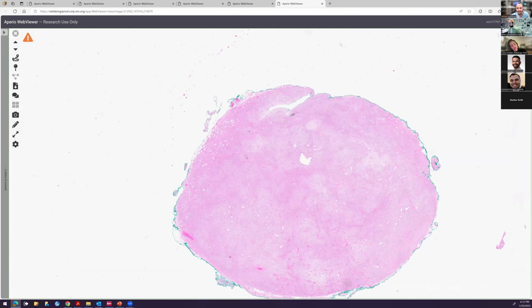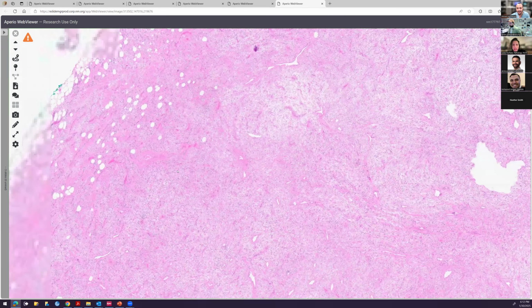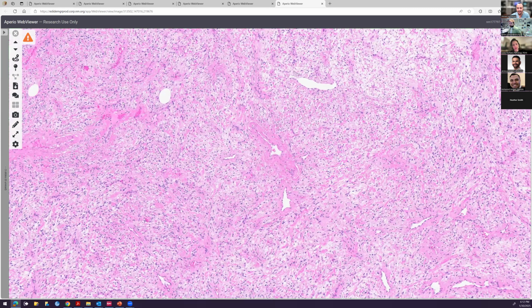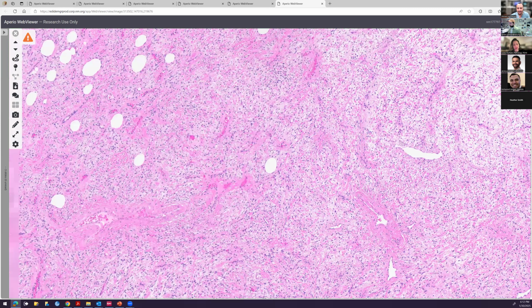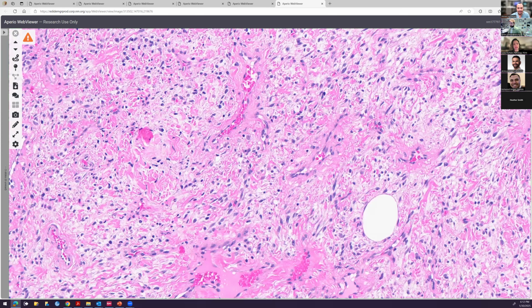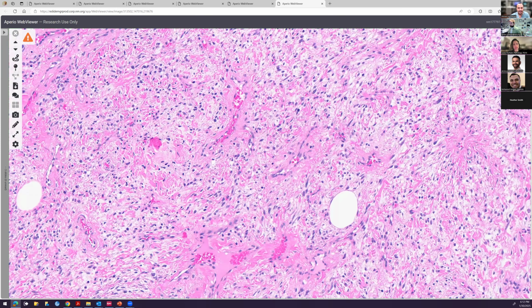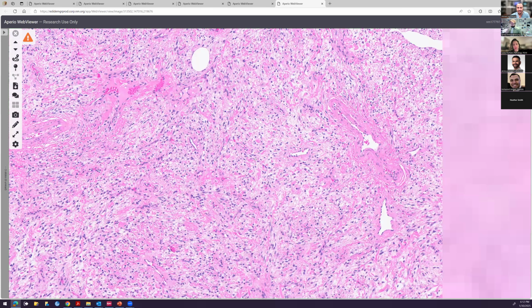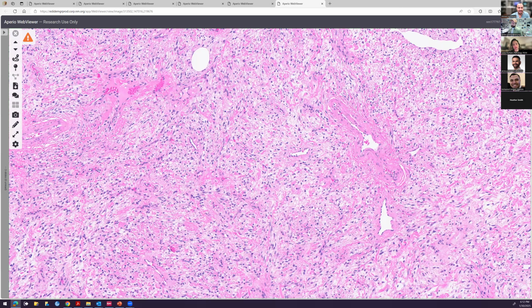Here's another example of one. This one, much more vascular. There's a lot more vascular cells throughout it. But again, adipocytic cells throughout, kind of fibrotic to collagenous, ropey collagen to hyalinized background. And this one actually has some more staghorn type vessels, which is totally okay. Right. Okay, what do you want to do for this? Well, morphologically, you could diagnose it, but is there any way you can kind of aid yourself to prove it?